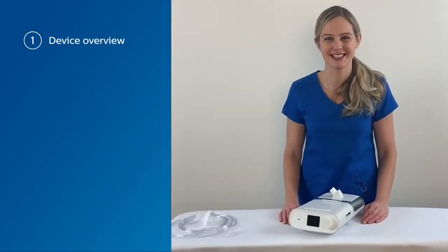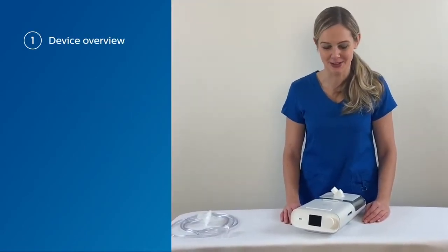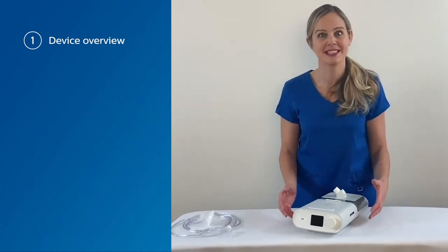Welcome to the Philips Respironics E30 getting started training video. Today we're going to go through the simple and easy setup of a new patient.